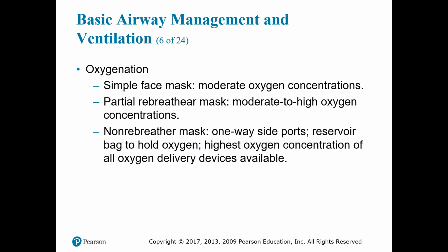So any oxygen that's overflowing is just going to flow out. If the patient draws more air in than the mask is providing, then they're going to pull in room air with it, which is fine because if you've got them on a simple mask, they probably do not need that much oxygen anyway.